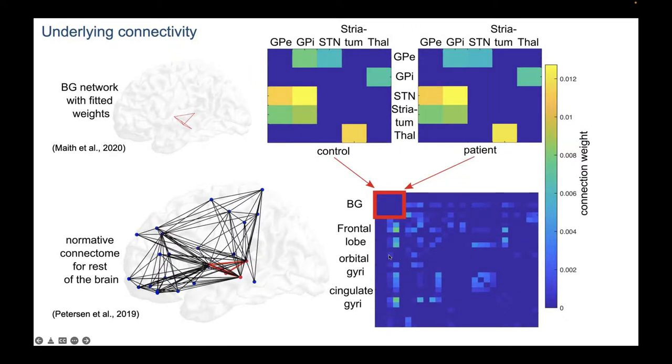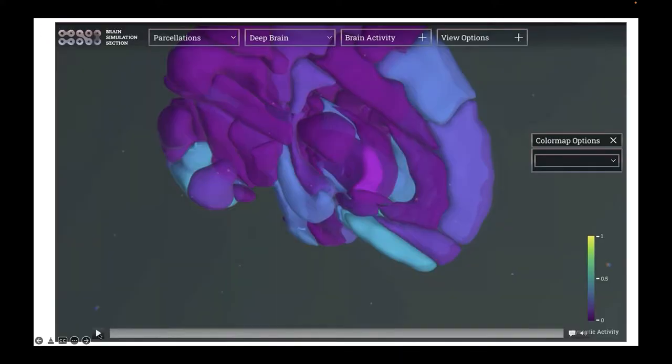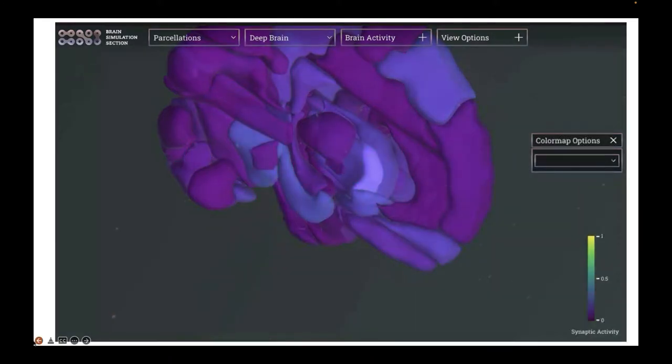They used histological data, they used DTI, so lots of MRI data. They also used holographic vision, which is quite fun if you want to check out this publication, of expert neuroanatomists that were there with those virtual reality glasses, deciding and looking whether a connection was probably a false positive or false negative, and how they have seen these connections going through their experience in surgeries, and what their intuition is. So it's quite a mixture of methods used to get to a good idea of what's happening on the connections between the basal ganglia and the brain. That's what we used it for.